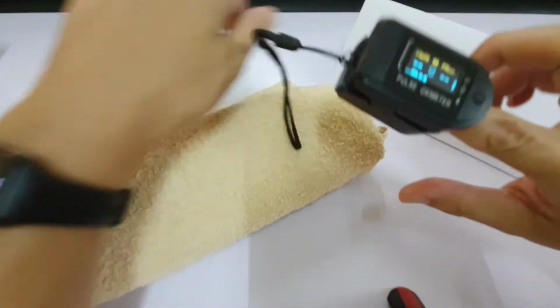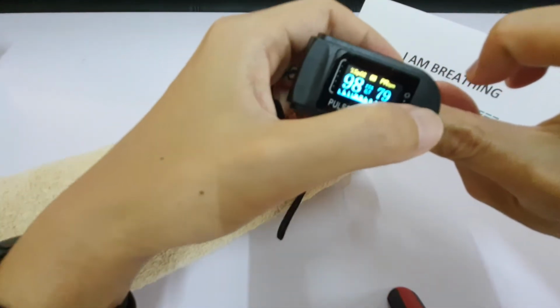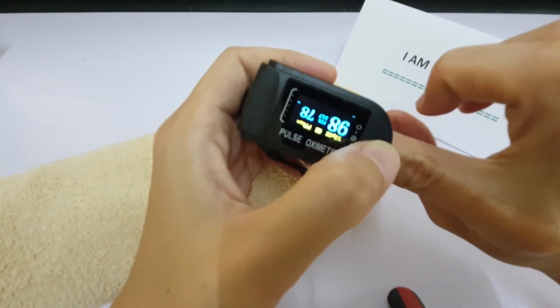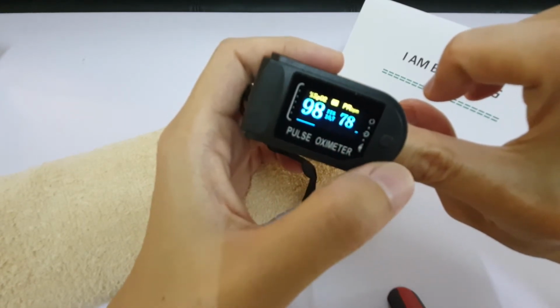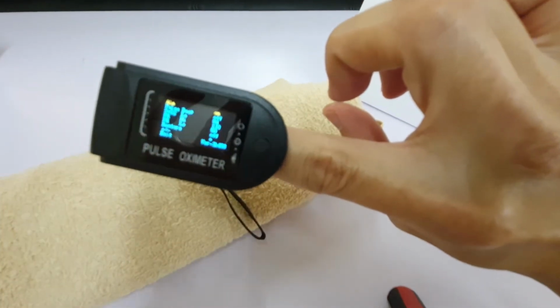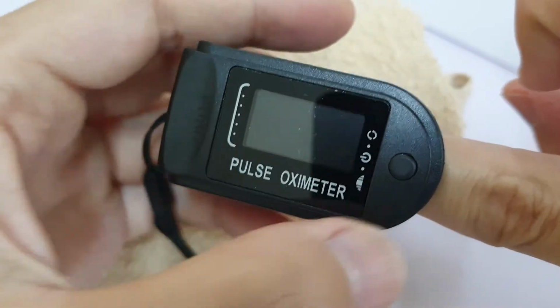But before that, I want to also show you that most of these oximeters will have, when you click the button, it may rotate the display. And for this particular unit, if you long press, it gets into the, let me just zoom in. Let me just say that again.